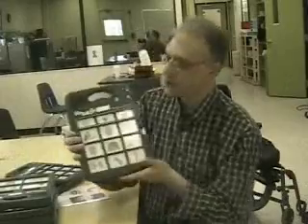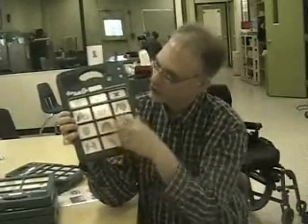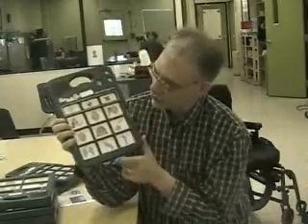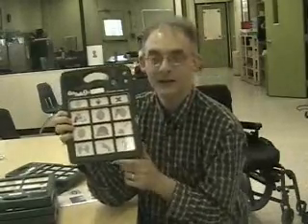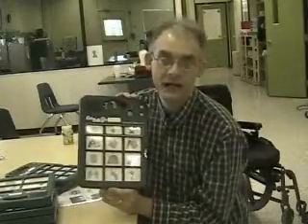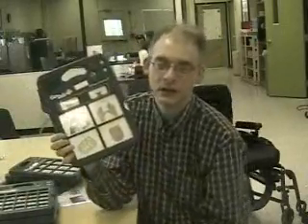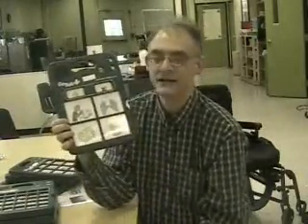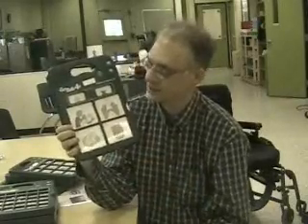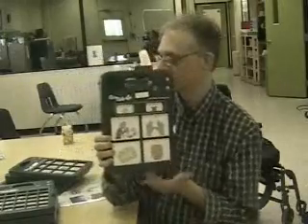Here's another GoTalk 9, and you see I have parts of the body up on here, where we talk about the parts of the body: washing, brushing teeth, combing hair, taking a shower, doing some different things with personal grooming, personal hygiene. And here's a GoTalk 4 of that same kind of overlay. It's a lot more basic because I only got 4 spaces, but this is for somebody with a little bit lower ability than my GoTalk 9.